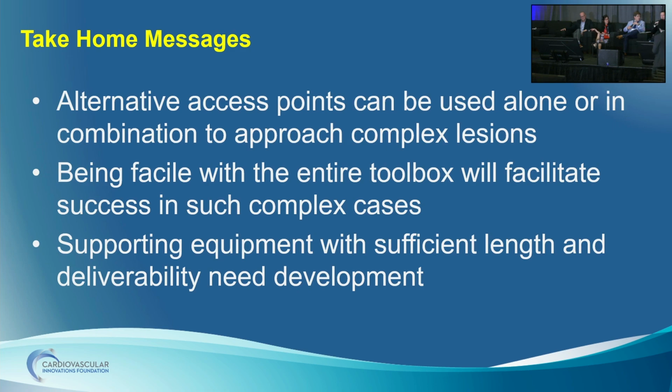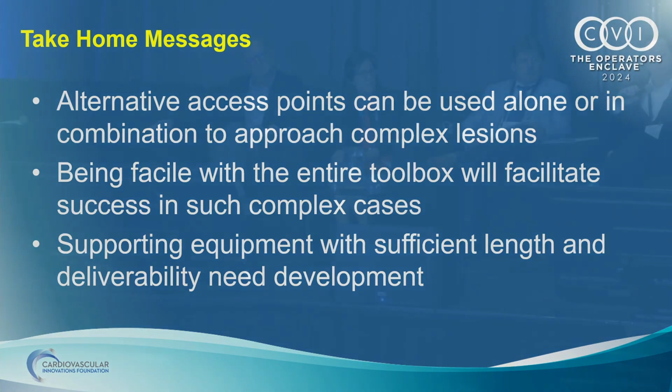That's a great case, Sanjum. Let me ask you a question regarding how you closed up your DP access? So we just used Terumo bands for both the DP and the wrist. We don't routinely do dry closure, but I know some people do that. Yeah, some people come from above and put a little balloon on, but obviously you're not going to come from the wrist and come all the way down.